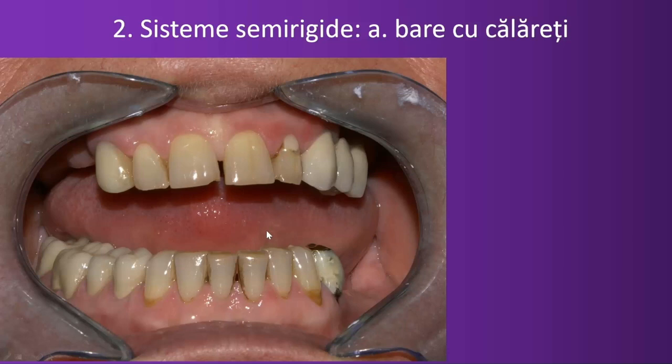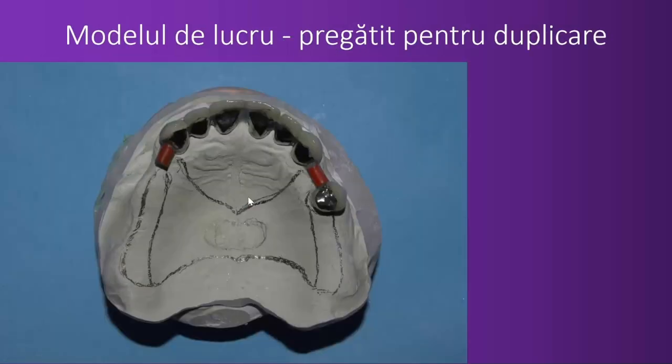And so we needed a combined denture, right, to cover those teeth somehow, and then implants, or the other way, to modify, to cover these teeth and then to do a denture. Okay, so let's do a combined denture. That's what it is. So you see 3 elements and a bar with a rider distally. This is not orthodox. The bar is normally placed like that, interdental, right? Like here, like in the image.